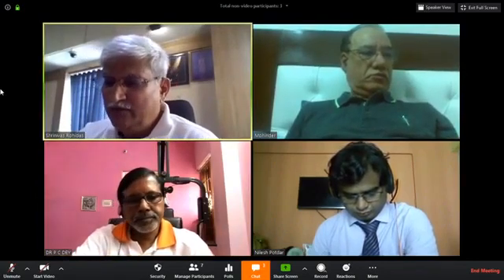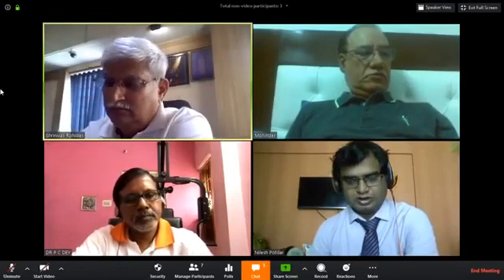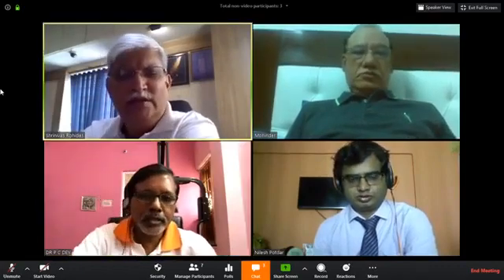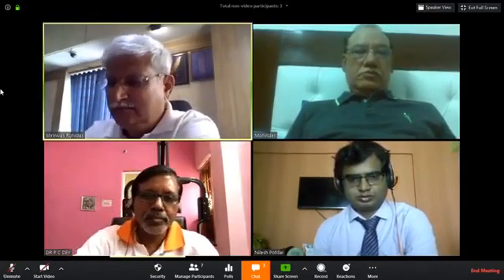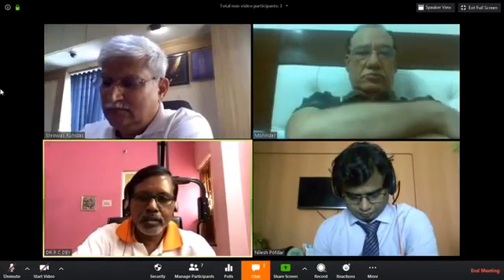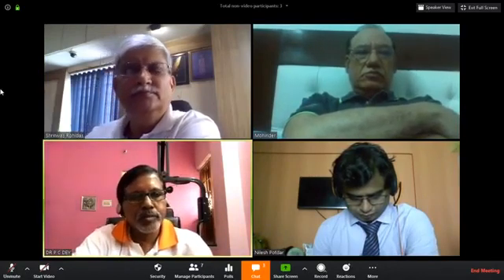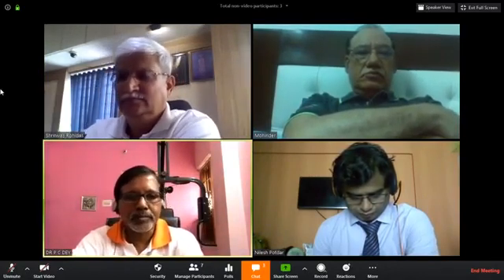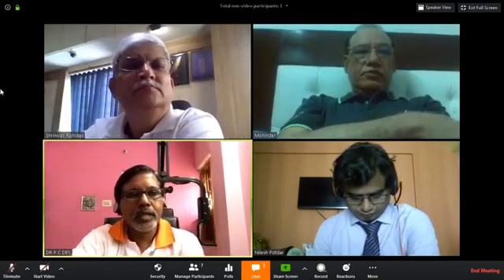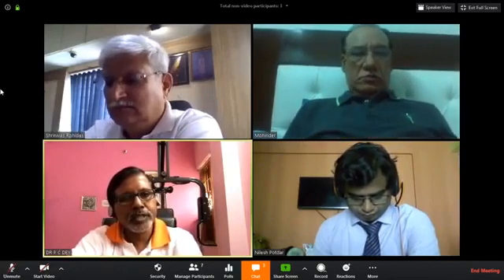Yes. Dr. Vijay from Jaipur: how to cut the capsule to reach the disc? That you saw in the video. You can cut with your operating instruments, the round trephine. You can put the number 10 blade or the number 11 blade. Whichever method is okay, no problem. Sometimes it is a hard disc, then it is a problem. If it is a soft disc, no problem. If it is a hard disc, then you may use a Kerrison punch, a 45-degree Kerrison punch, sometimes to cut that hard portion of the disc, then go inside.